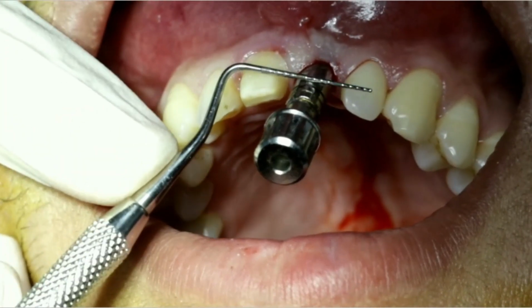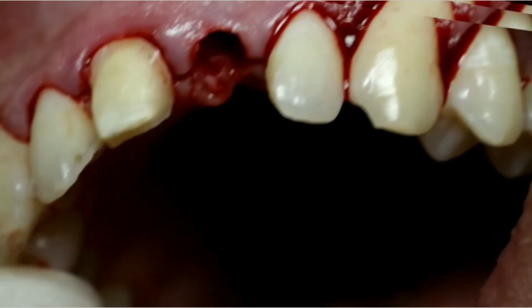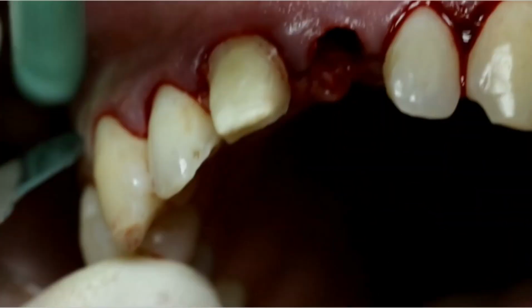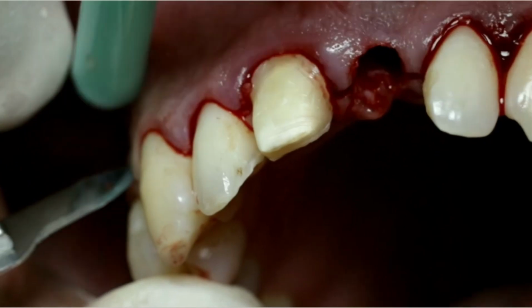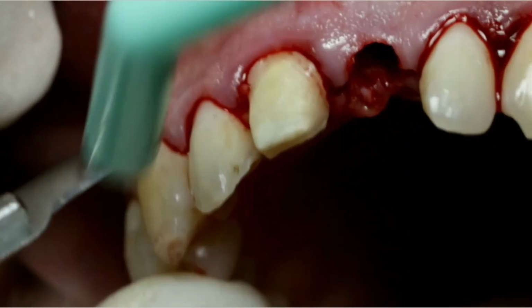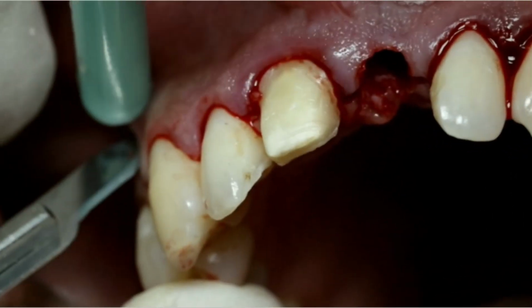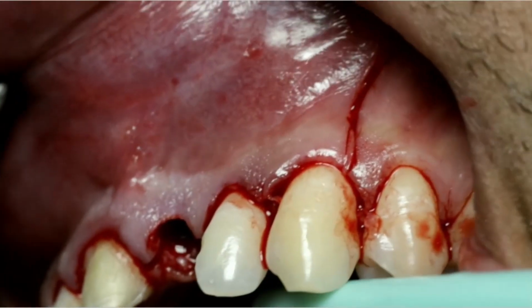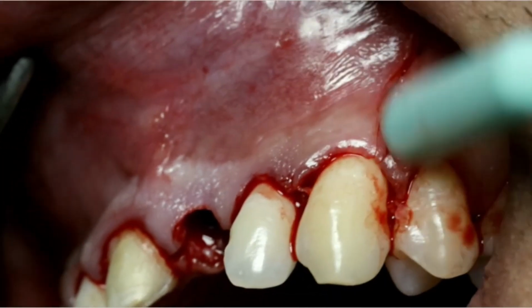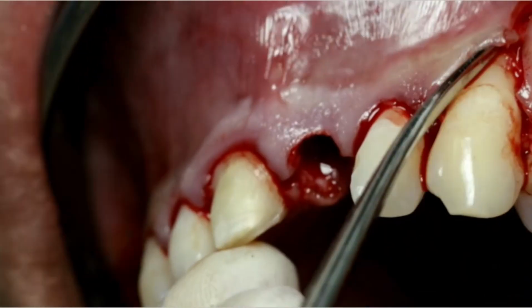But this case needs ridge augmentation, so we start our ridge augmentation procedure and make our flap design with two vertical releasing incisions, reflection of the labial flap, and exposing of the bone deficiency area.